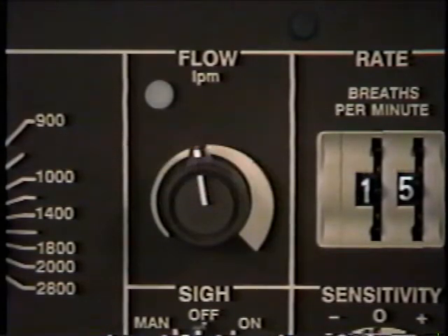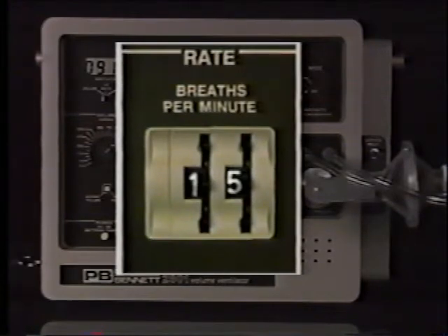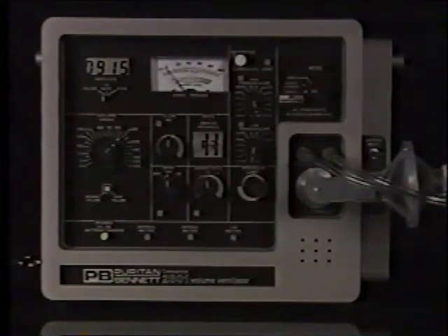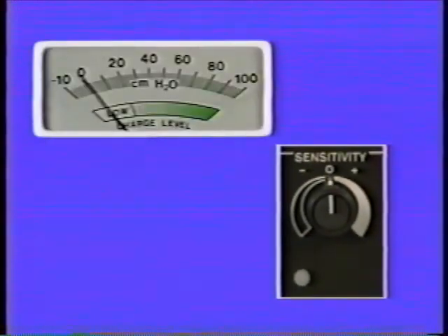The breaths per minute control consists of 2 thumb wheels that will adjust the ventilator to deliver from 1 to 69 breaths per minute. The sensitivity control is used for the assist, control, and SIMV modes only. It sets the level of inspiratory effort that the patient must exert in order to initiate a breath. Regardless of its setting, the patient is never locked out from spontaneous breathing.